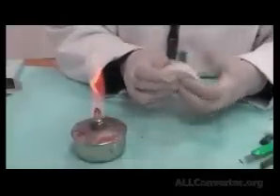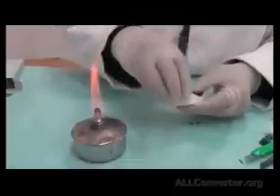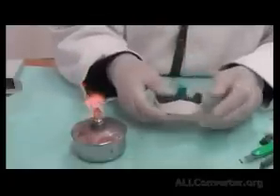What I'm going to ask the patient to do is try to blow his lips, or I would pull the lower lip up and to the sides. I would take the cheek up on this side, the cheek up on this side, and laterally to border mold this area.